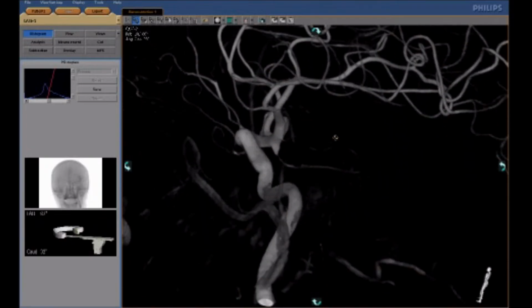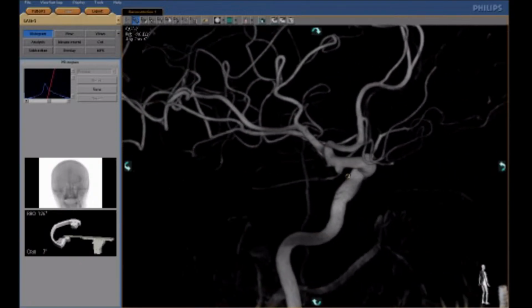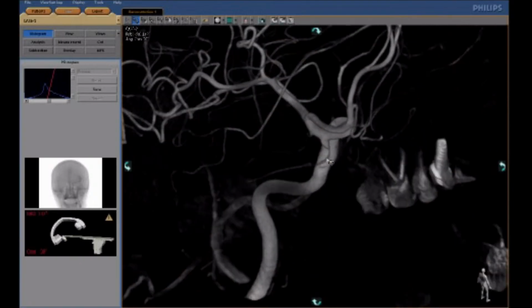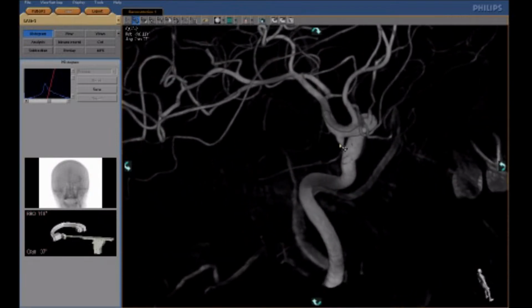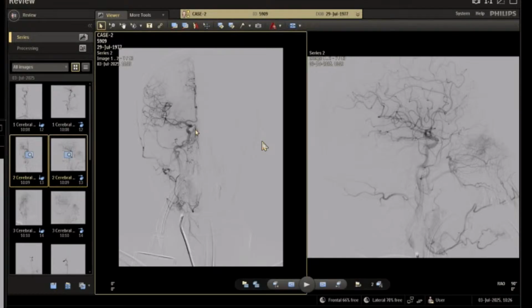It's aneurysm number 1, and I think it's problem number 1. This is an infundibulum, and the artery is coming from the dome of the enlargement. Okay, let's see the review.